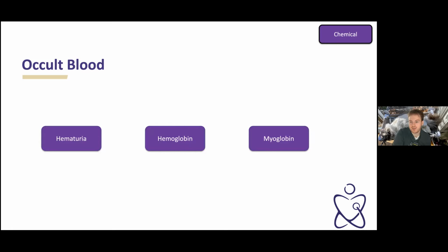Common conditions that are associated with hemoglobinuria are going to be burns, trauma, transfusion reactions, hemolytic disorders, malaria again, and then strenuous exercise or March hemolysis. And if microscopy does have RBCs, then you need to be evaluating it manually under a scope to see if there are any dysmorphic reds.